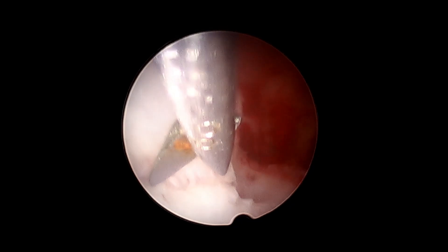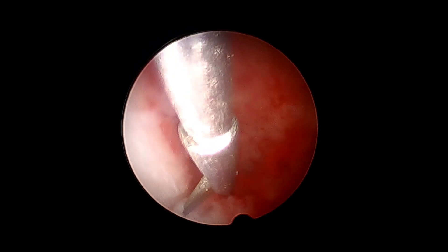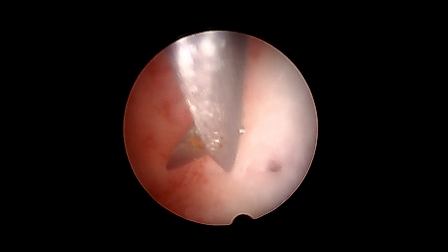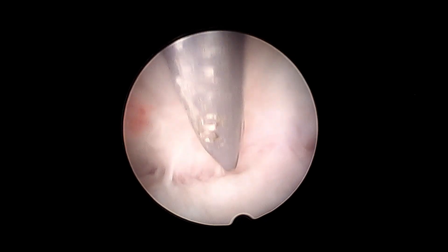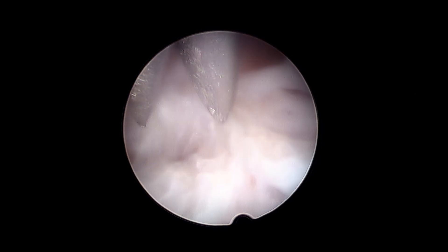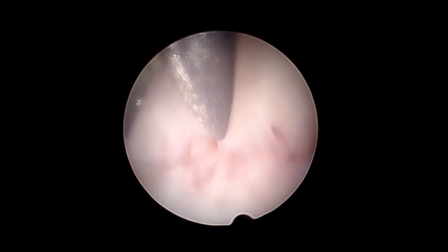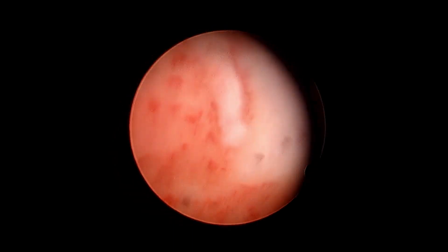Also while doing septoplasty it is very important to keep track of the fundal myometrium — the fundal myometrium is going to be seen as pinkish-colored tissue at the apex. Once you reach the fundal myometrium it is vital to stop there, because if you keep digging into it there is a high chance of entering the abdominal cavity and causing perforation at the fundus. One trick: decrease the pressure in the uterine cavity by lowering the saline pressure, and you can see the blood vessels trickling blood inside the cavity.